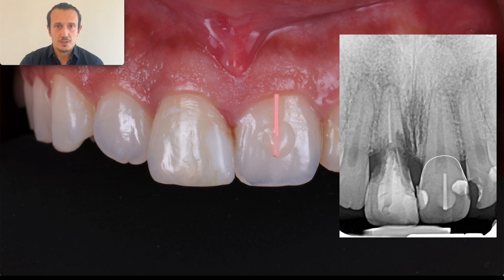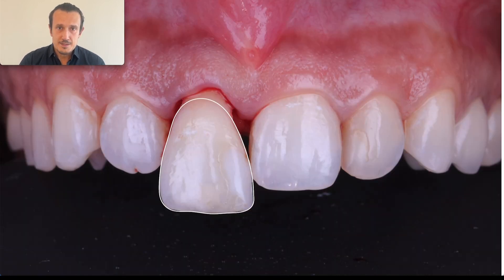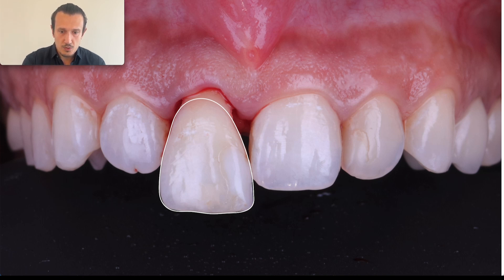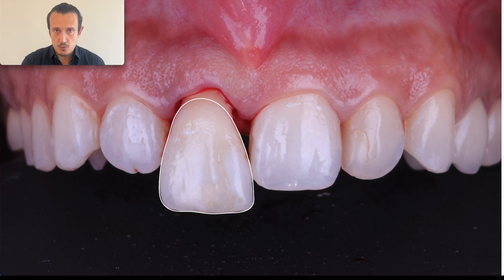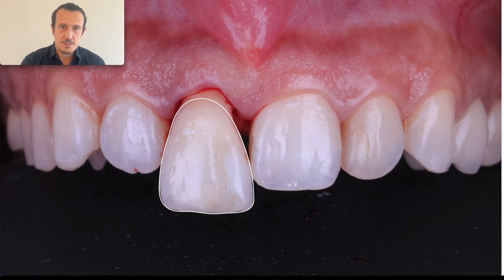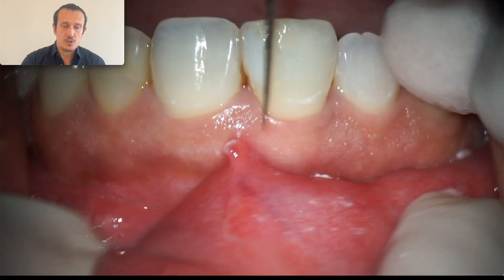This is a picture during the surgery when I extract the tooth. You can see the difference between the anatomical crown of the extracted tooth — it is almost the same crown as the natural tooth, but it was not visible because it was covered with soft tissue. So we're going to start with the extraction.